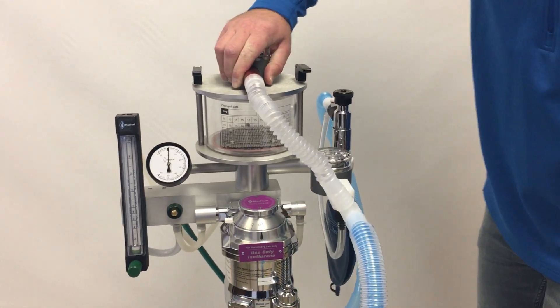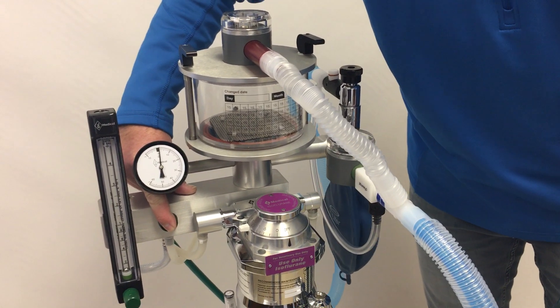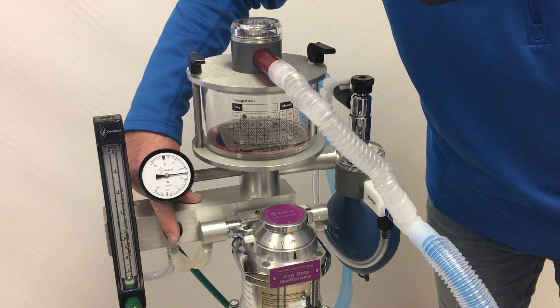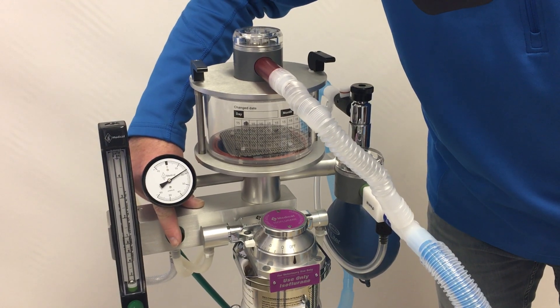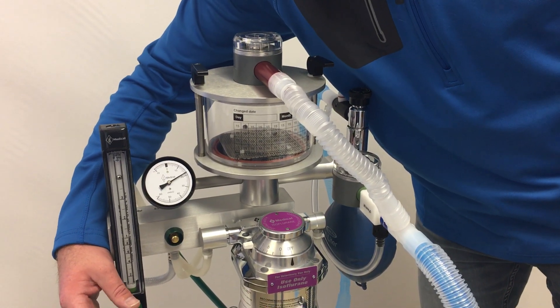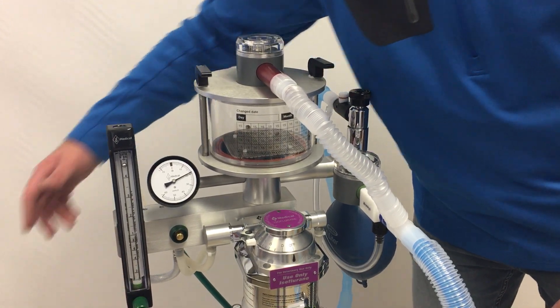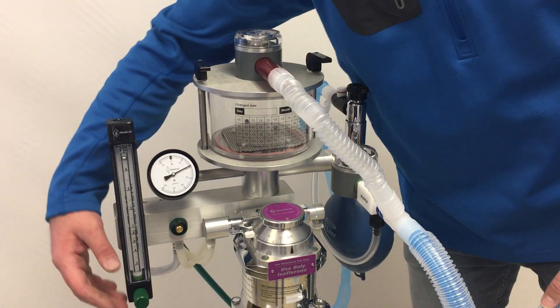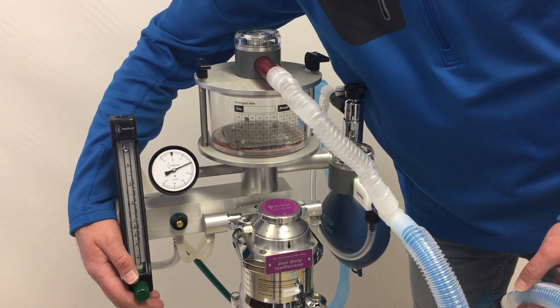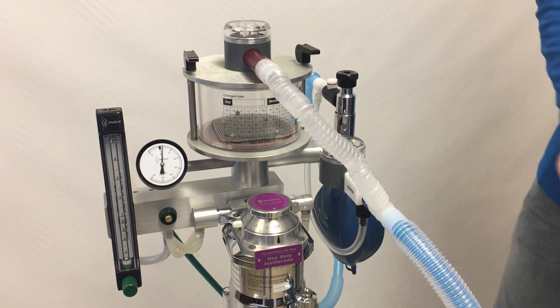We can demonstrate this by closing the pop-off valve and building up a little pressure — you can see it opens as the pressure goes above 20 centimeters of water and quickly relieves it back down. With sustained pressure, such as by increasing flow with the pop-off valve closed, it won't build above 20 centimeters of water pressure, giving you time to identify the problem and open the pop-off valve.